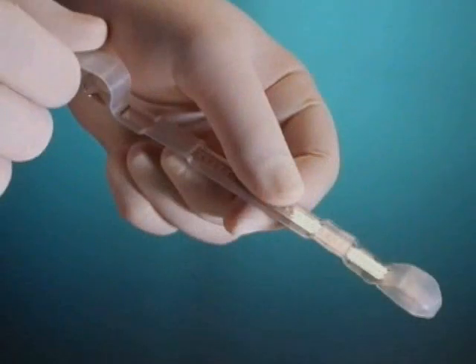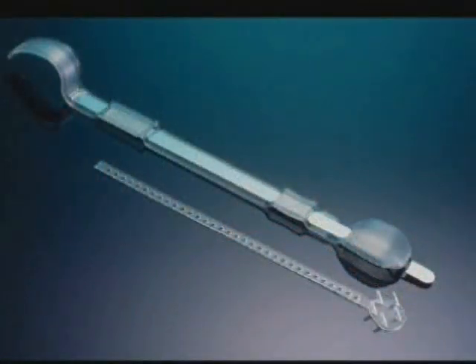The midface device consists of two components: the insertion tools, which are designed to facilitate introduction of the fixation platform through a temporal approach, and the endotine midface implant, which consists of a fixation platform and anchoring leash used to elevate and fixate the cheek subdermis during a midface suspension procedure.